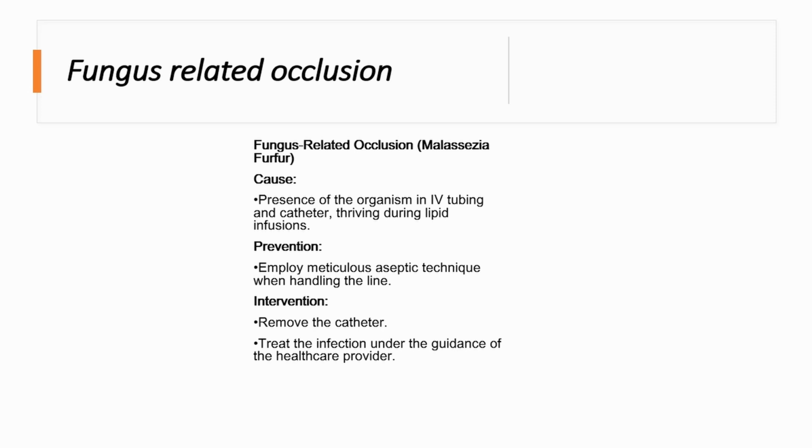Prevention. Aseptic technique: always maintain a meticulous aseptic technique when handling the PICC line, especially during the preparation and administration of lipid infusions. Monitor catheter and IV lines: regularly inspect for signs of infection or occlusion, especially when administering lipid solutions.